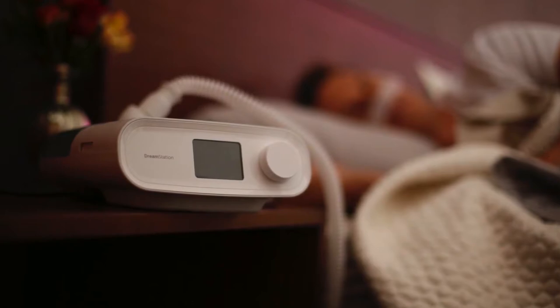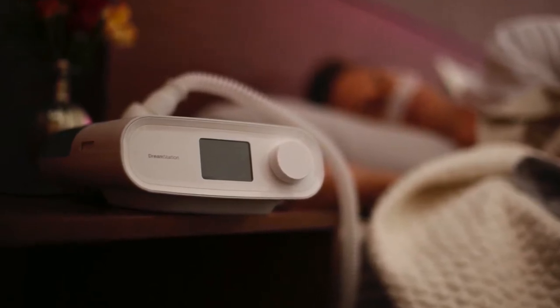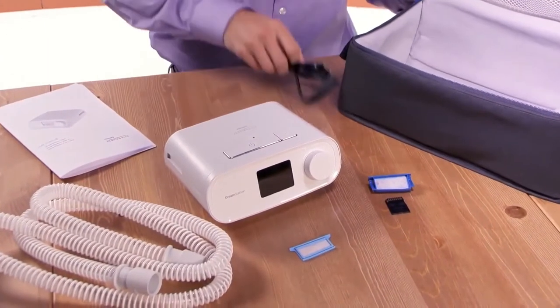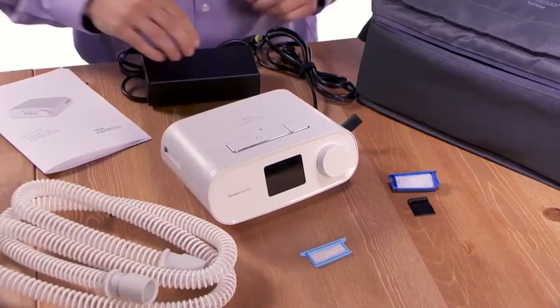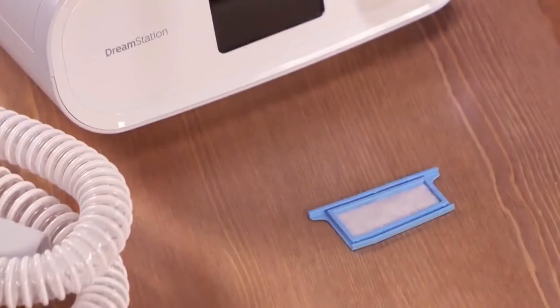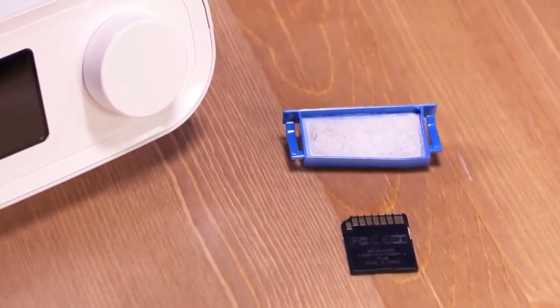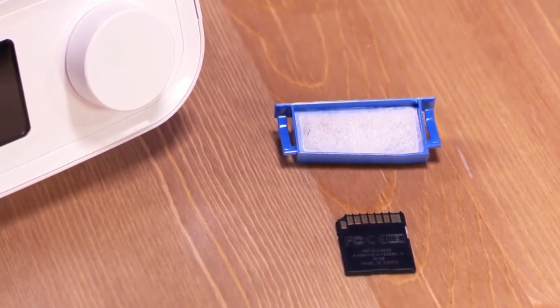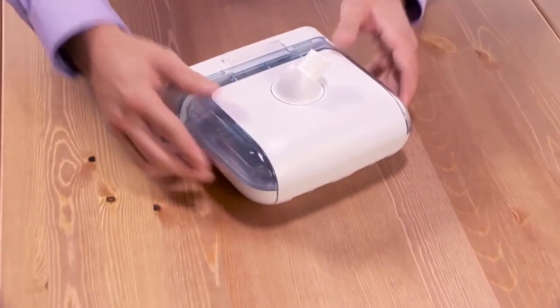DreamStation is a positive airway pressure therapy device designed for the treatment of obstructive sleep apnea. DreamStation devices come with a carrying case, power cord, power supply, flexible tube, disposable ultrafine filter, and user manual. A reusable blue pollen filter and SD card come installed in the device. A humidifier is an optional accessory.